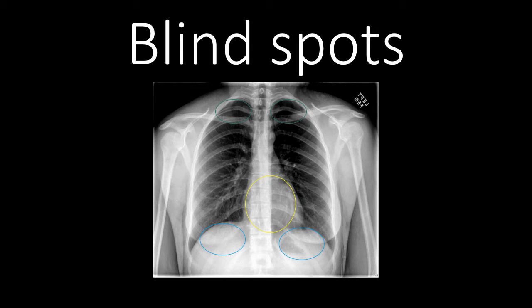It's also important to remember there are a few blind spots in the chest. In the lung apices, you have overlapping ribs and clavicle, and sometimes nodules or masses can get obscured in this location. Remember that behind the heart and behind the diaphragms, we still have lungs superimposed. Always look carefully in these locations to make sure you're not missing a subtle abnormality that's obscured by the diaphragms or the heart.